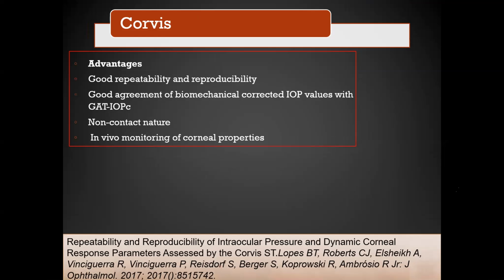It is non-contact in nature, monitors the corneal properties in vivo also, and has good repeatability and reproducibility. We need to check this device more, and cost is definitely a factor.